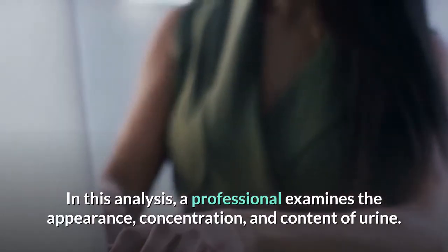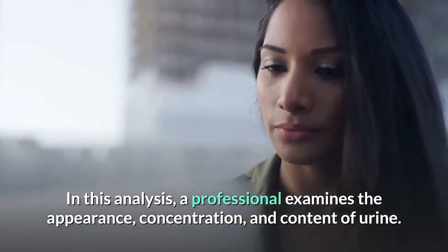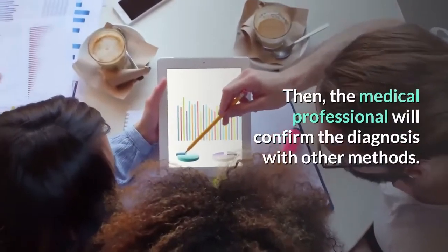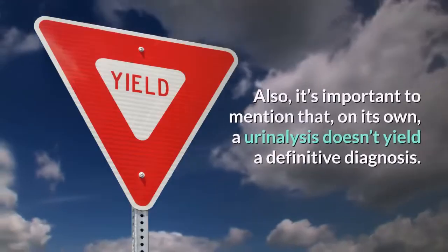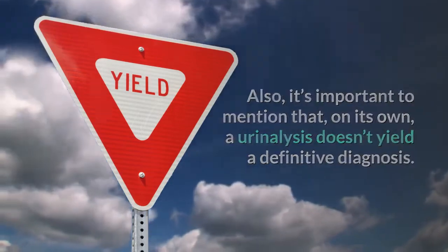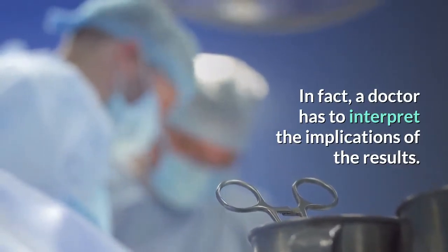In this analysis, a professional examines the appearance, concentration, and content of urine. The results may suggest the presence of a disease. Then, the medical professional will confirm the diagnosis with other methods. Also, it's important to mention that, on its own, a urinalysis doesn't yield a definitive diagnosis. In fact, a doctor has to interpret the implications of the results.